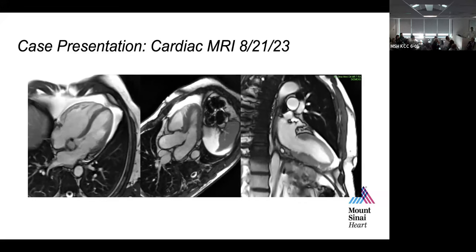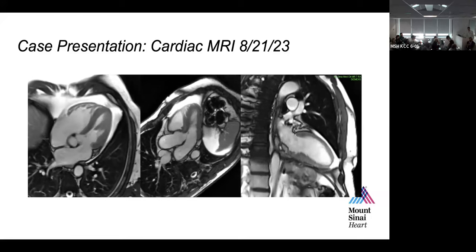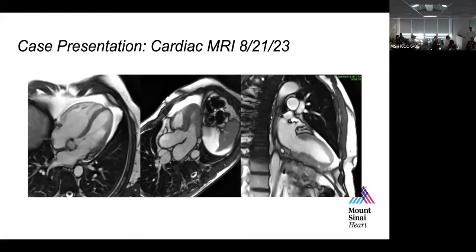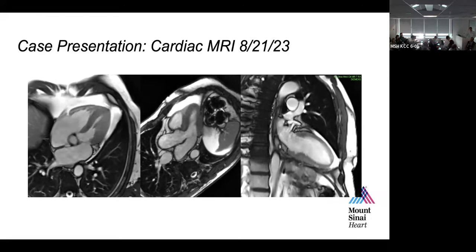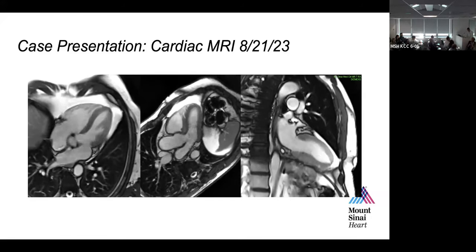Otherwise, you can miss it even with MRI. So, just a quick point, to echo what has been said over here. One of the things that, at least when I was a general cardiology fellow, I did not realize, is that cardiac MRI can miss a lot of things if you're not looking for it. This is something that should be mentioned. What it means for the general person out there is: be very specific with the questions that you're asking. The questions that you ask determine the protocol that we do. Otherwise, the patient can be under the scanner for 3-4 hours and we still would not have answered all the questions.